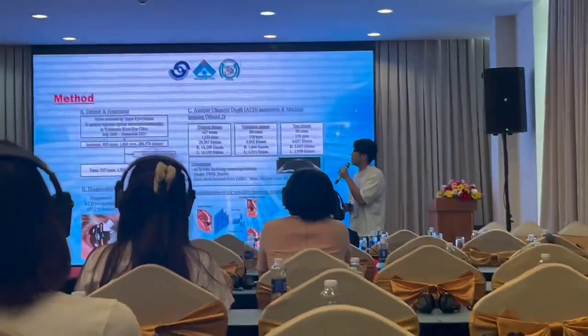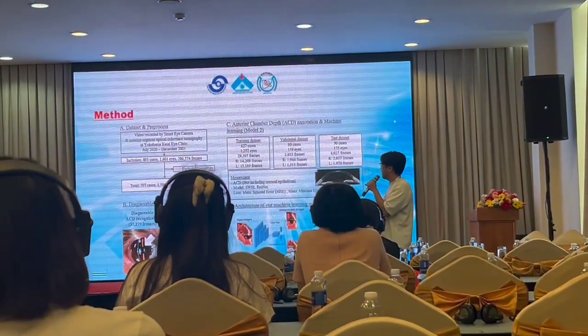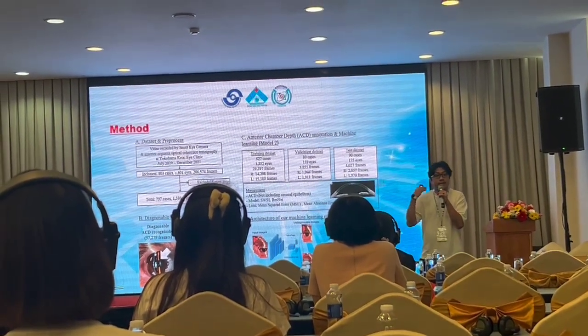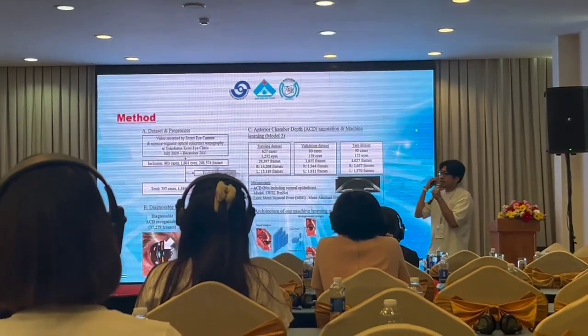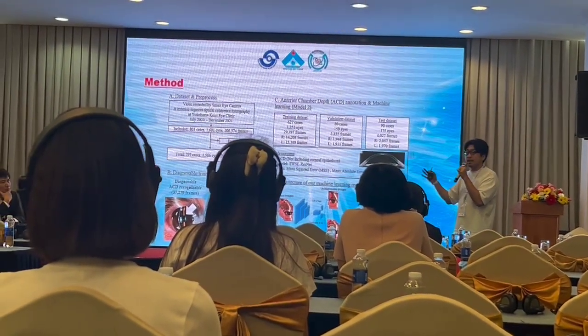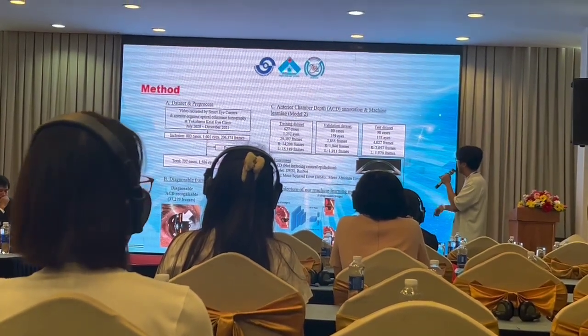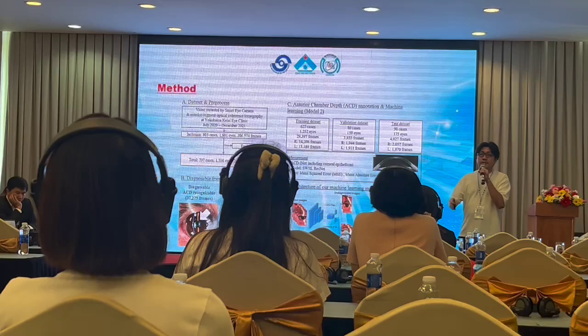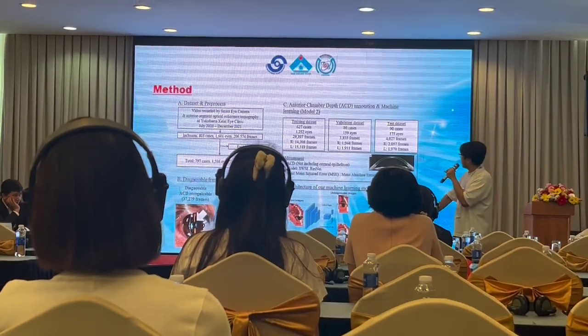We have exclusion criteria. The data is only phakic. So we exclude the IOL, the pseudophakic eyes, aphakic eyes, and other complications which could not allow visualization of the anterior chamber.